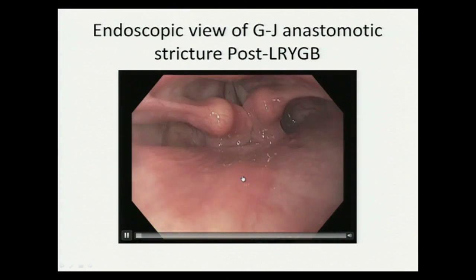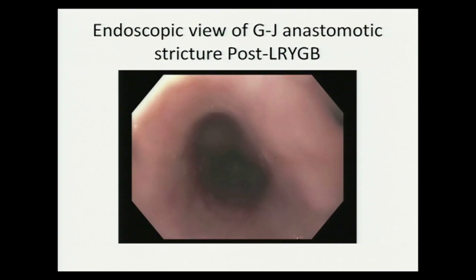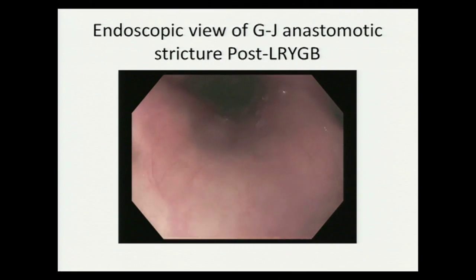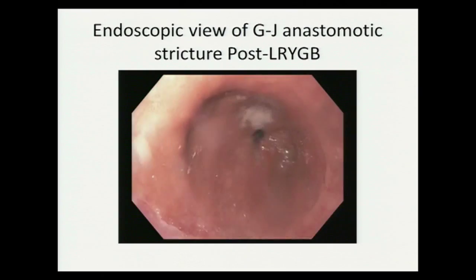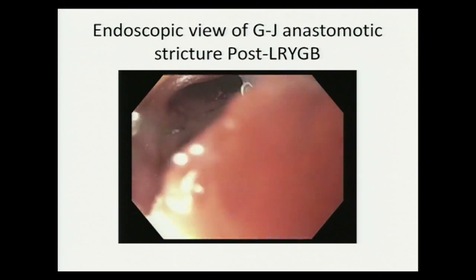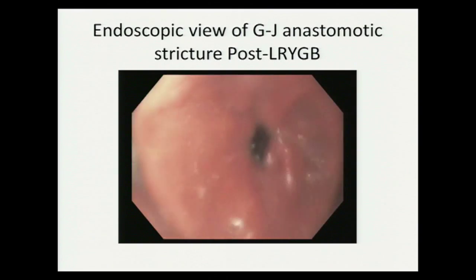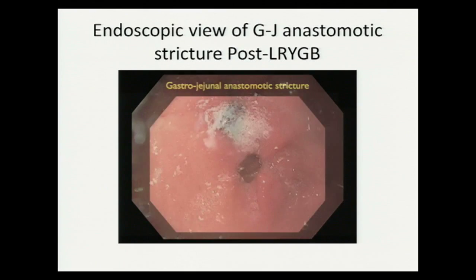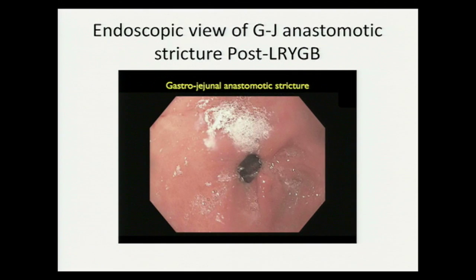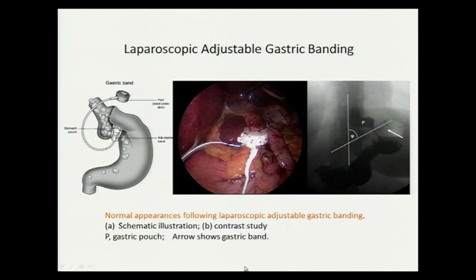Strictures, I know there will be a talk about strictures, but I want to just highlight the difference in the anastomosis of the gastrojejunostomy. As you become more experienced in doing these, you'll recognize what is a normal and an abnormal anastomosis, but more often than not, the best tool is your endoscope. If you use a standard diagnostic endoscope and you have difficulty passing that endoscope through the anastomosis and the patient has the typical symptoms, then more often than not we consider that a stricture. And you can see here the difference in the size. This is clearly difficult for the endoscope to pass through when we do a CRE balloon dilation.